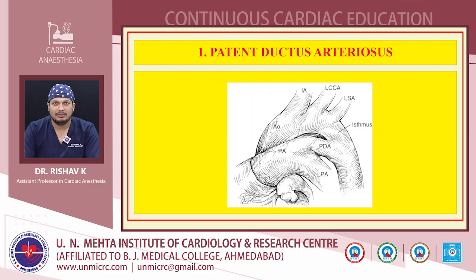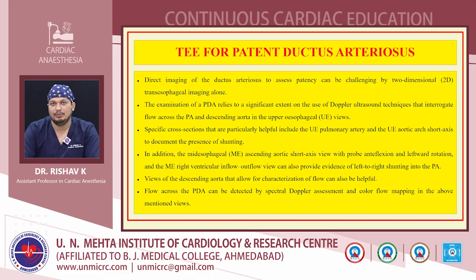First, coming to one of the most common lesions in the great arteries, that is patent ductus arteriosus. As we can see here, the ductus is a remnant of the fetal circulation, and it essentially provides the communication between the aorta and the pulmonary artery. As such, direct imaging of the ductus arteriosus to assess the patency can be challenging by 2D echocardiography alone using the transesophageal approach.